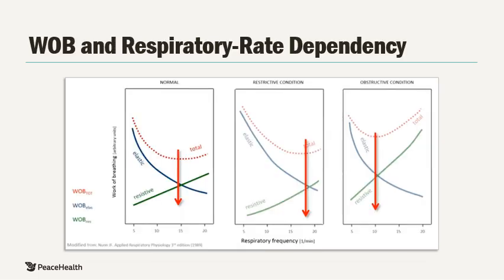For the selection of breathing pattern and respiratory rate, ASV focuses on work of breathing and lung mechanics, specifically the difference between a normal lung, an obstructive lung, or a restrictive lung. To do this most accurately, ASV uses the Otis formula.